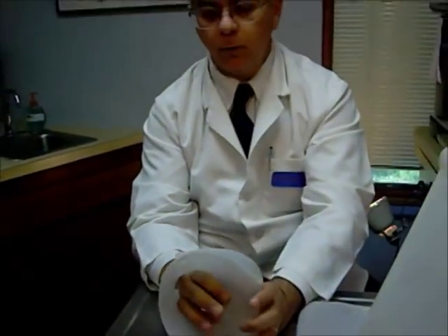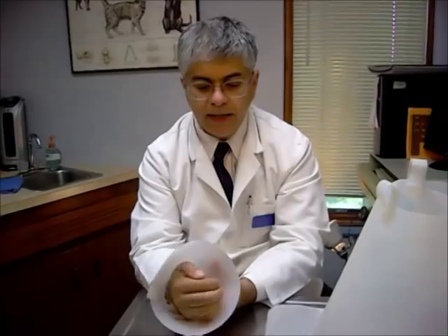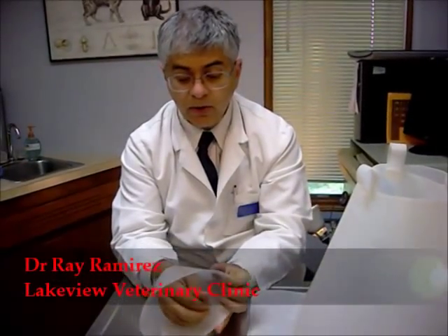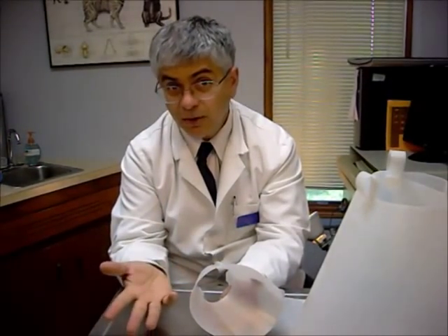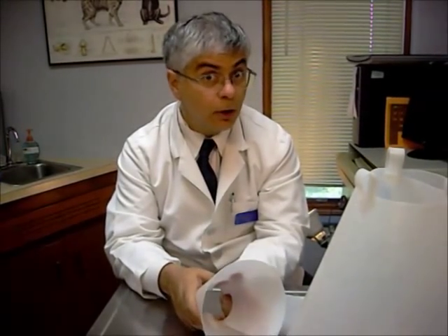So now we've got a little cone for a little head to pop in there, so that he or she doesn't get at the incision we're trying to keep them away from. This helps them heal better so we can help them live longer — which of course is our ultimate goal here at Lakeview Veterinary Clinic, where we help our pets live the best life possible for as long as possible. If your pet needs an e-collar, talk to your regular veterinarian. And if you don't have one, we'd love to see you at Lakeview.